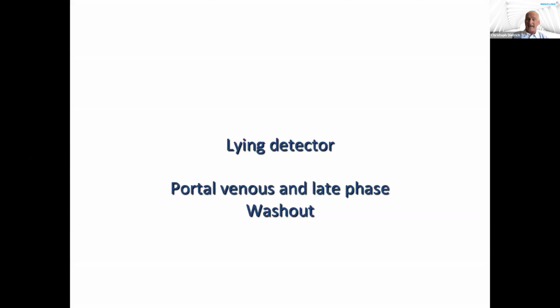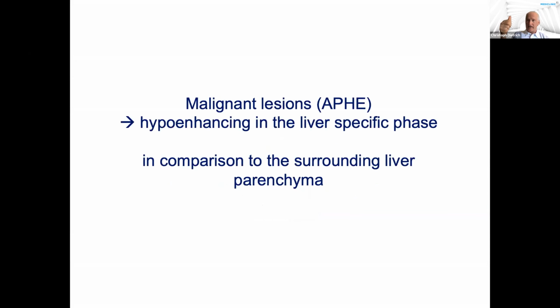It is a lie detector, the portal venous and late phase. If that shows wash out, arterial phase hyper-enhancement and wash out, then it could be a malignant focal liver lesion or inflammatory. At least we have to clarify the diagnosis.